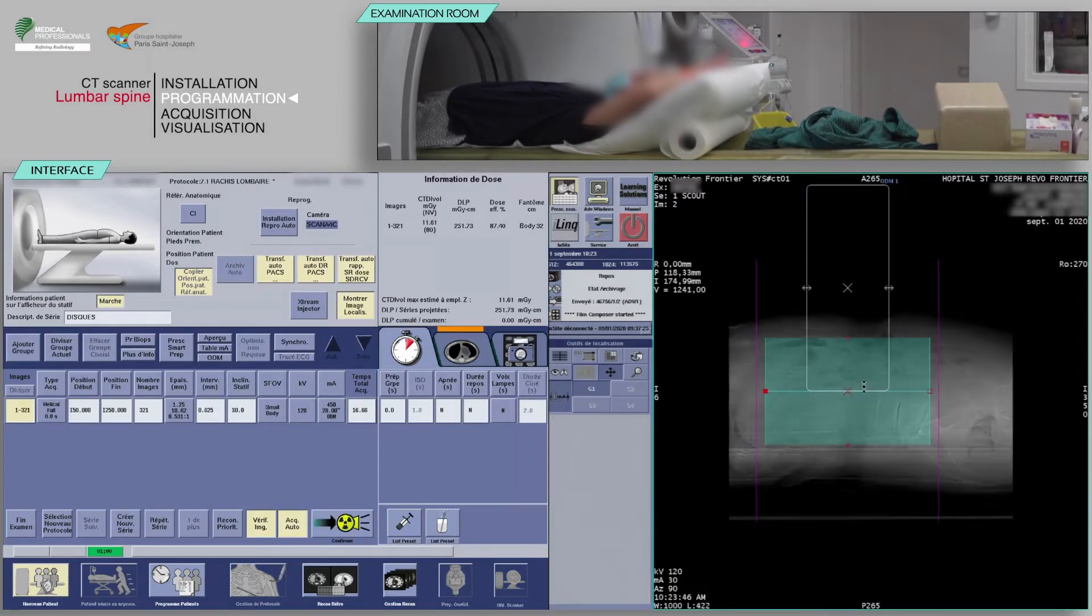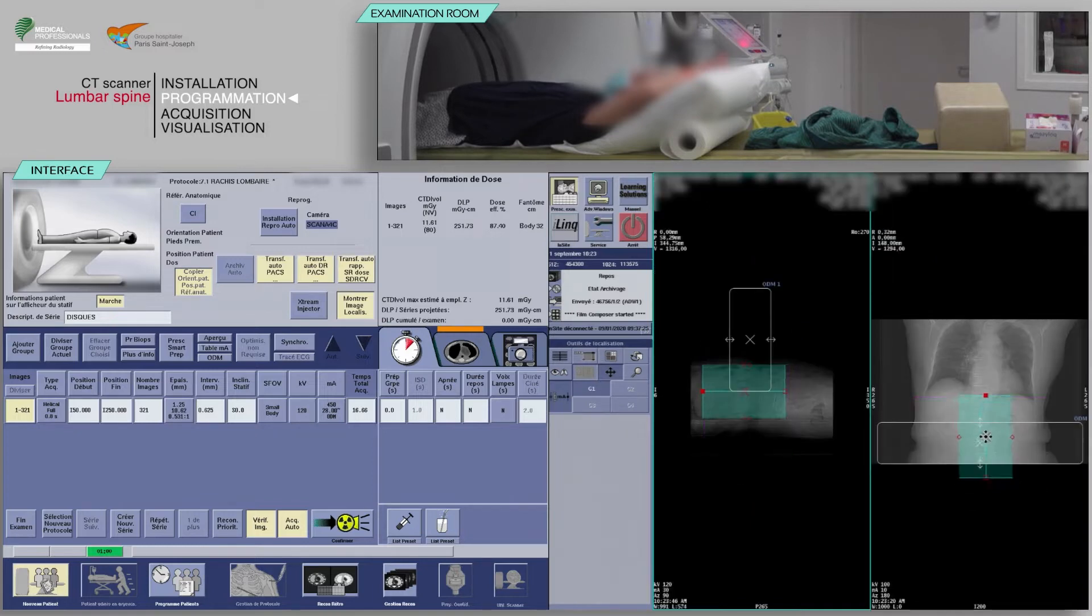This trick allows you to avoid programming an acquisition zone outside the scan mode. The modulation of the MA is done from the most recent scan mode performed. The examination will now be optimized.